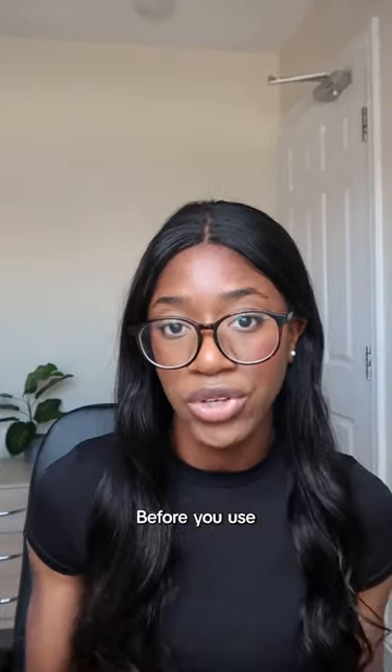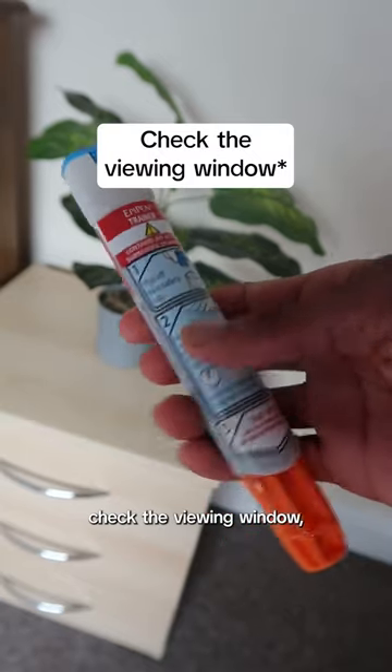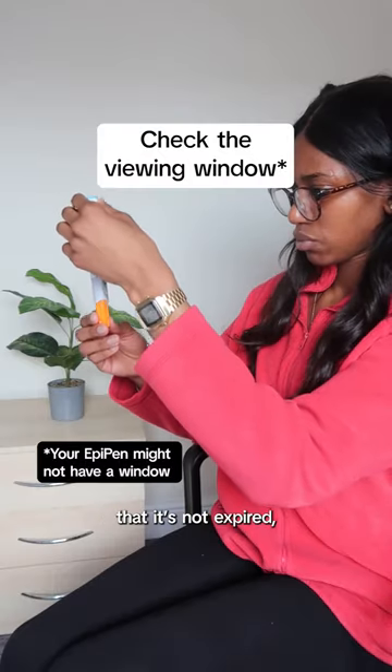Here's the correct way to use an EpiPen. Before you use your EpiPen, you want to check the viewing window. Make sure the solution is clear and colourless, and check that it's not expired.